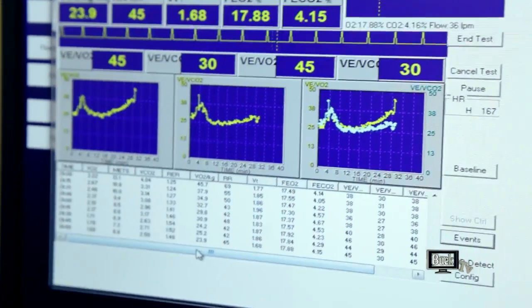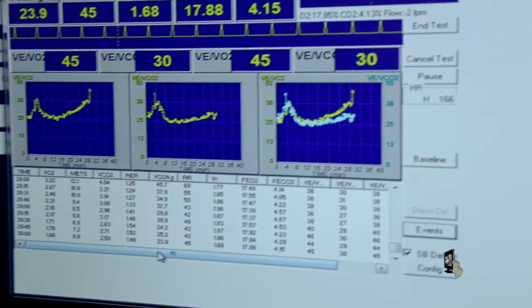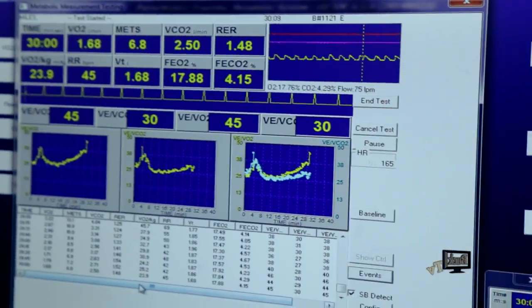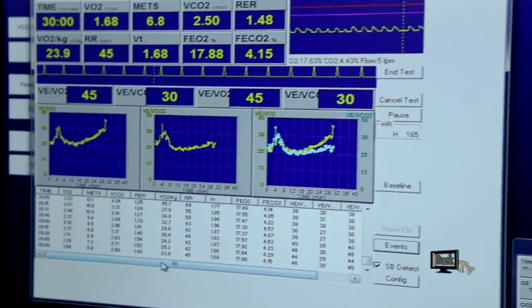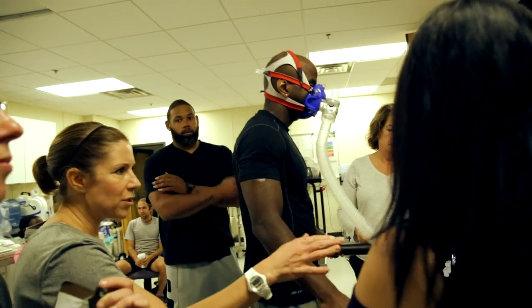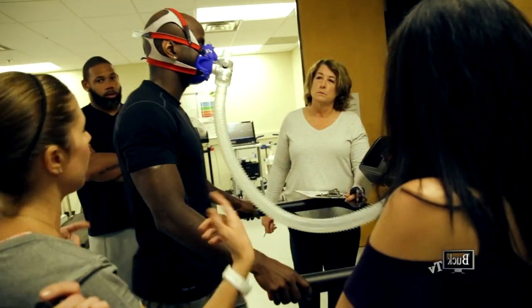You feeling okay, Marshall? Good test. Way to push through. And you can reduce the speed when you want to. Our goal is to bring you back right to that. I think he's already back to his heart rate. He's at 165 already. You can walk for as long as you want. We've got some recovery data. So you can take it down and then hit stop when you're ready. Then we'll unhook you and print out your data.